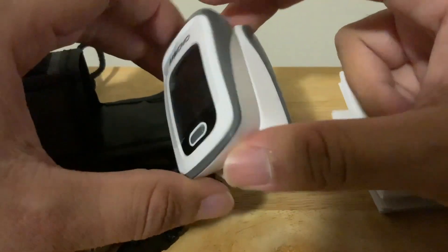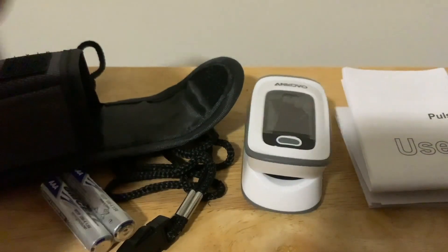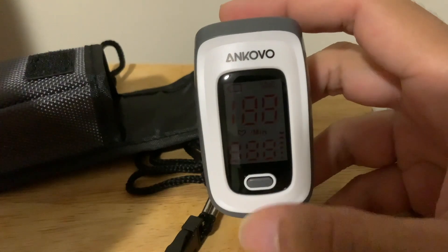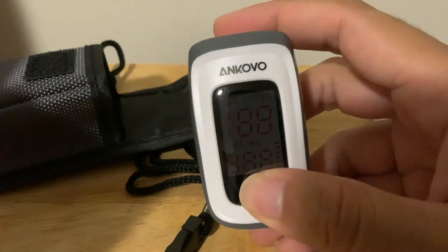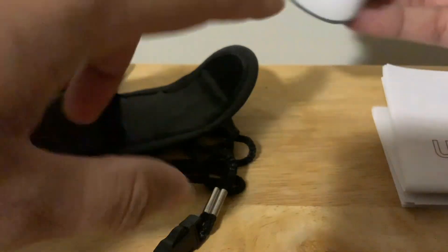I'll be giving my review as I use it — I'll let you guys know how it is. Now to start it, you're going to press this button, and I'm going to leave my finger here.